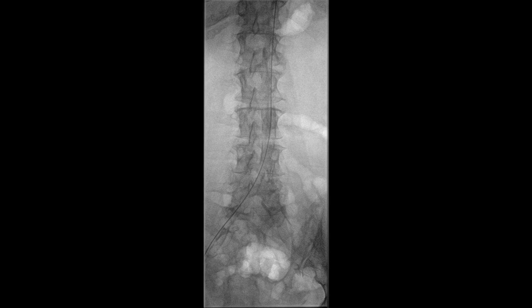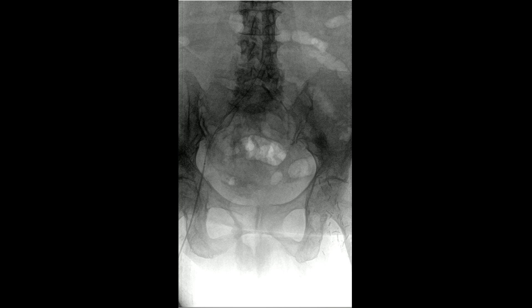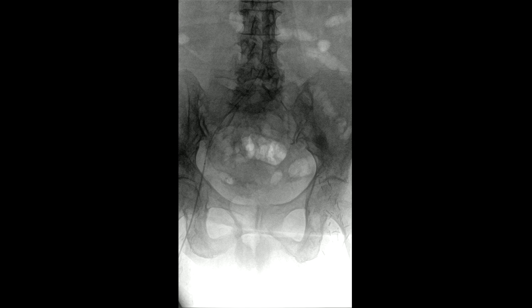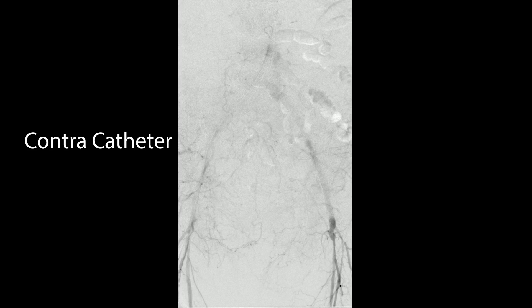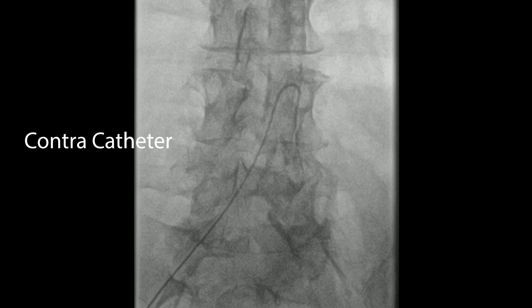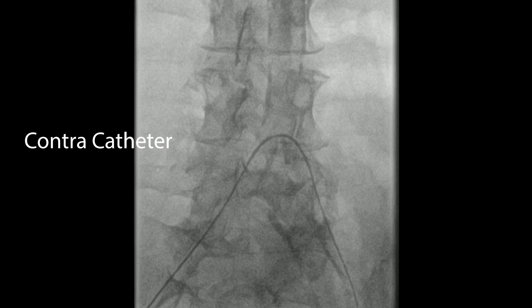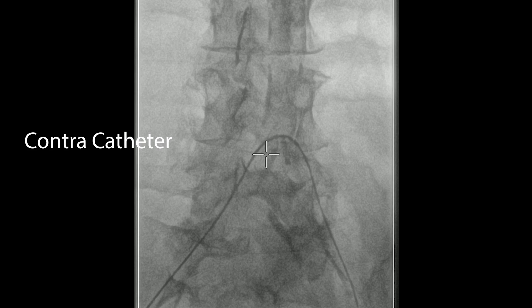We'll then introduce a flush catheter, as you do in the aortogram. In this case we'll be using a contracatheter. These flush catheters have multiple holes in the end that allow you to spray dye across the entire flow field, so you get a beautiful picture like that.